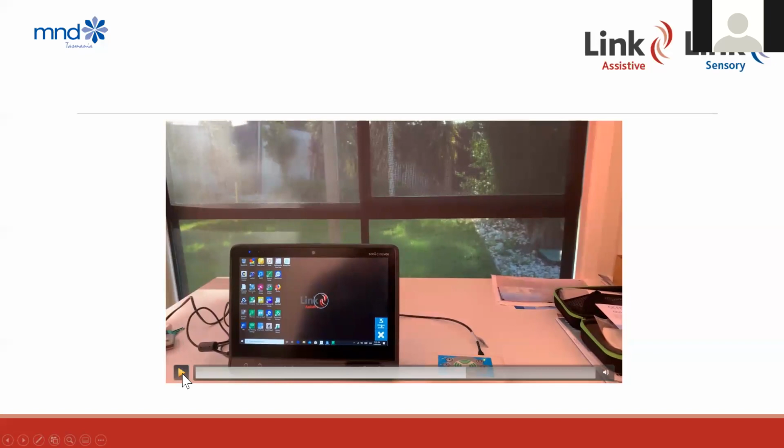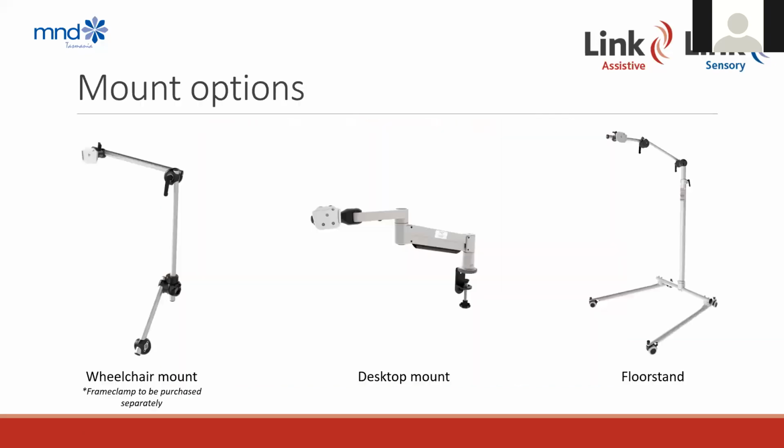Yeah, so you could see there, that's Bus, who is our owner and director of Link Assistive. He was using Communicator 5 software. So that's the software that you could see up on the screen. The red circle was tracking his eyes, and then he was holding that steady and then clicking with the switch. So you could see for him, that was a really efficient way of moving through the software. It was much quicker than if he'd had a dwell access on. Yeah, so that's just another nice option to know about and to consider.